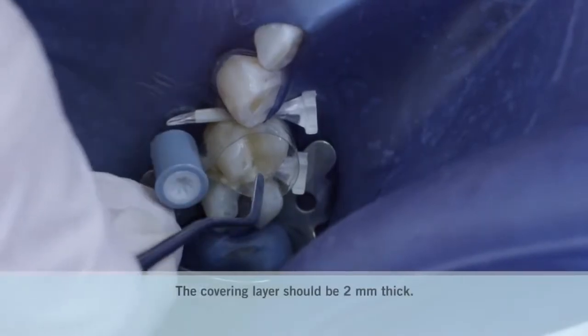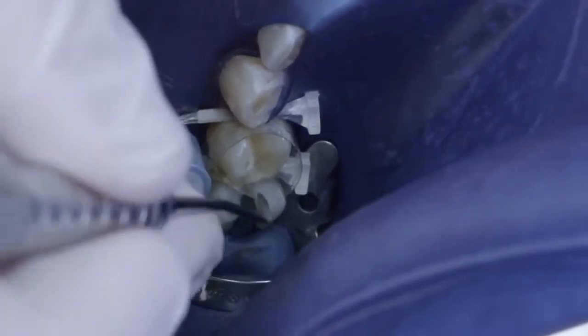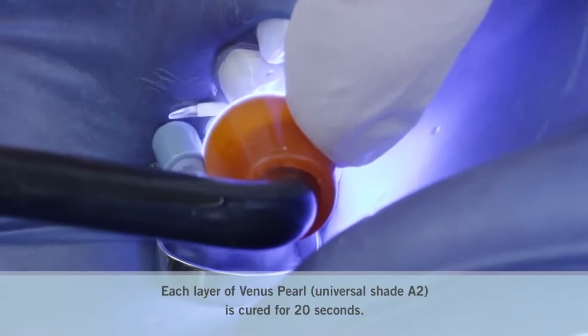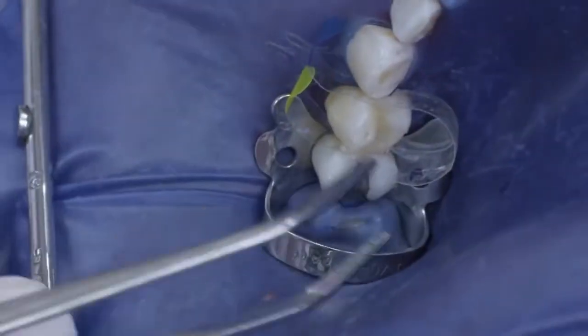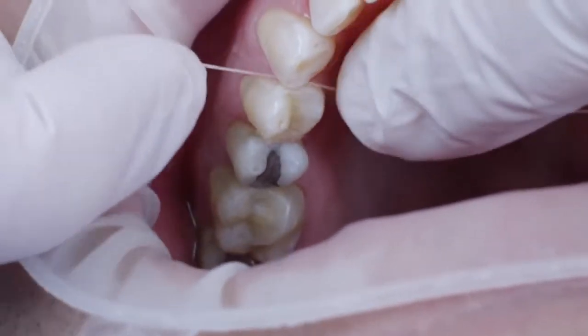The 2 layers of Venus Pearl A3 that followed reconstructed the occlusal surface as well as the other morphology of the tooth. The wedges and the matrix band were removed and the contact point verified using dental floss.